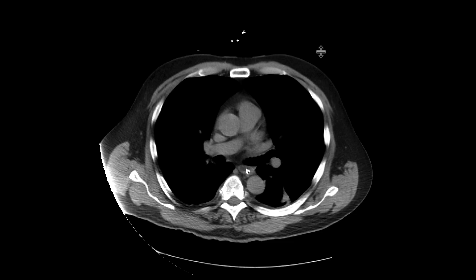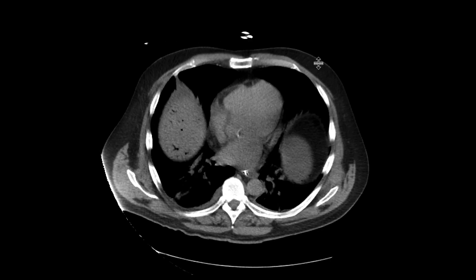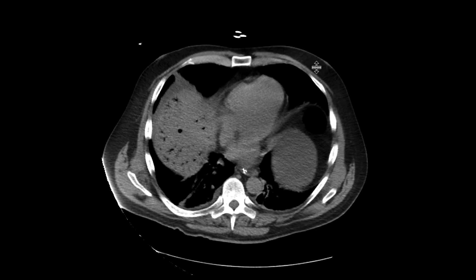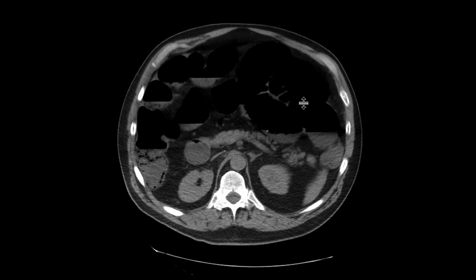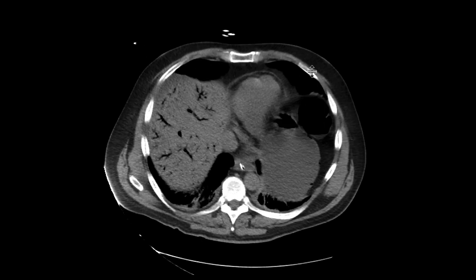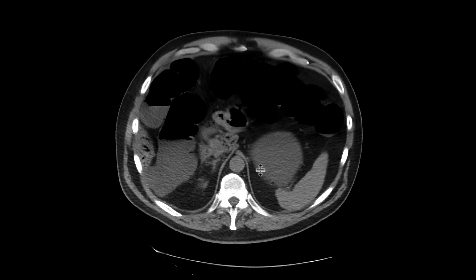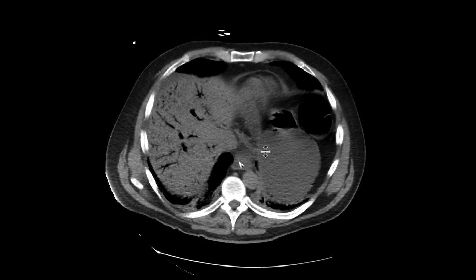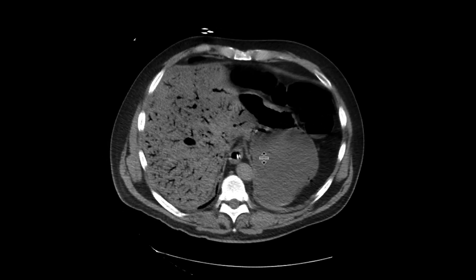This patient comes in with abdominal pain and got a CAT scan without intravenous contrast. We can already see there's extensive abnormality in the liver with all these branching lucencies. If we follow them, they look like they're in the portal veins, and this finding is highly concerning for ischemia.